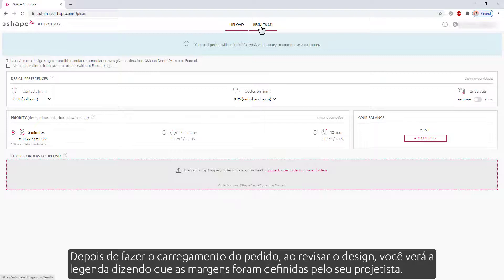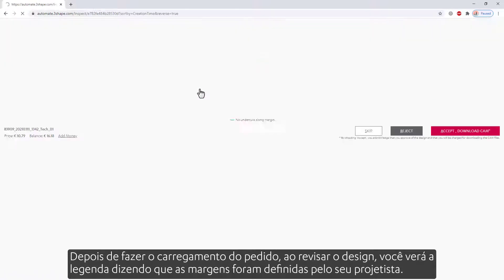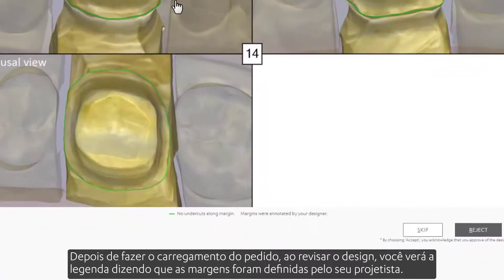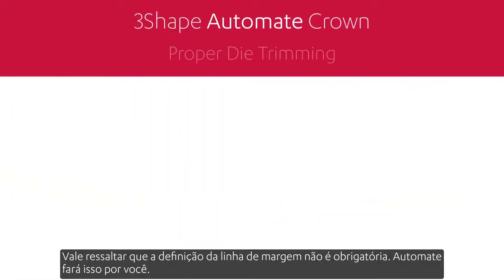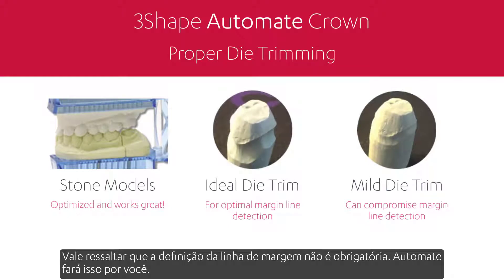After uploading the order, when reviewing the design, you'll see the caption saying that the margins were annotated by your designer. It is worth mentioning that setting the margin line is not mandatory — Automate will do it for you.